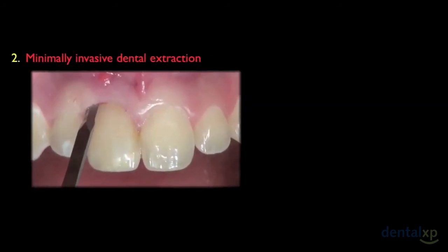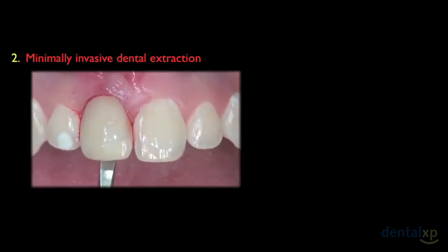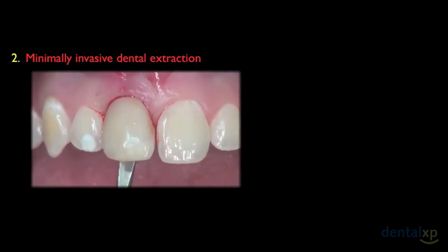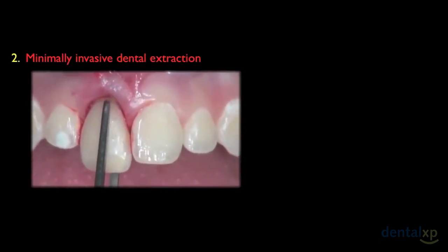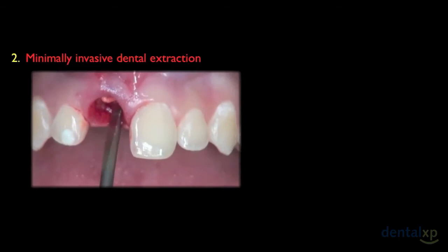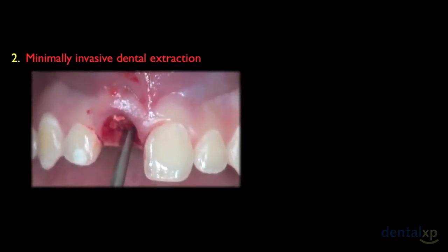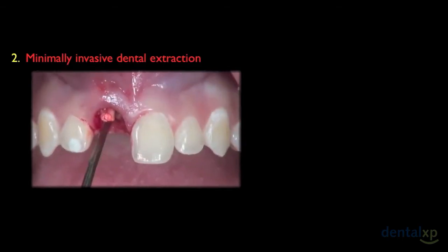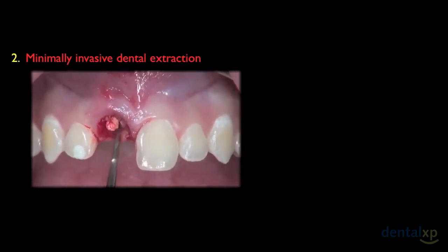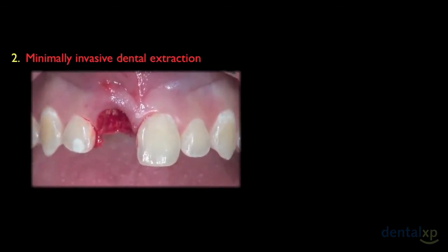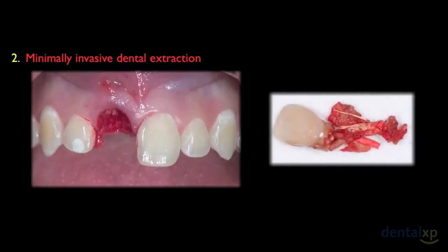The second step is minimally invasive dental extraction using a microsurgical blade, periotome, microlever, and atraumatic force — applying smooth movements and preserving the integrity of remaining bone walls. As this tooth was completely fractured, we removed it carefully in small pieces, avoiding traumatizing the soft tissues. Here we have all pieces of the tooth removed.